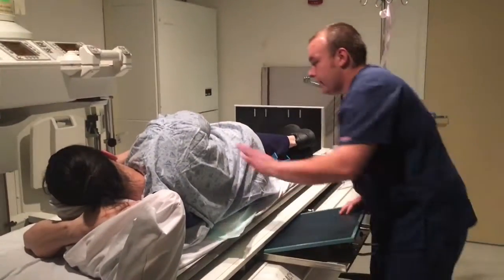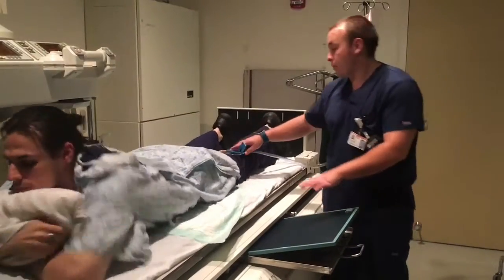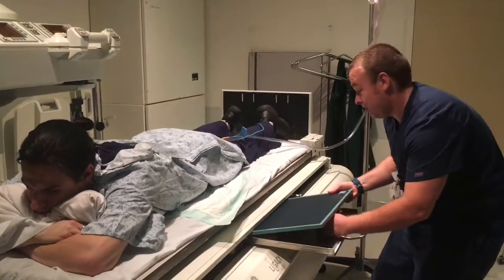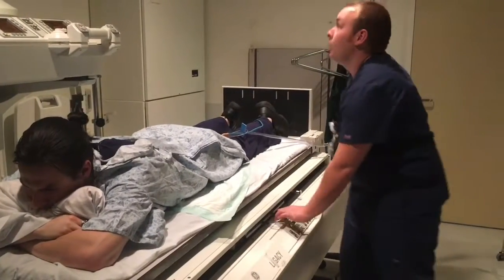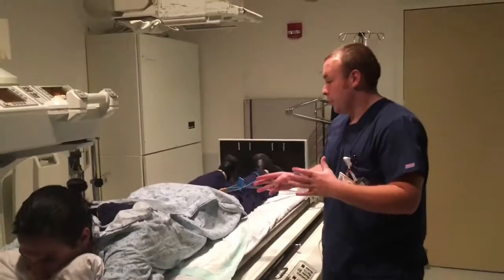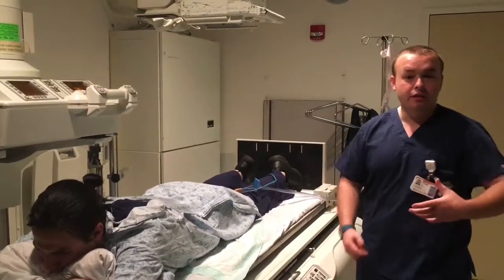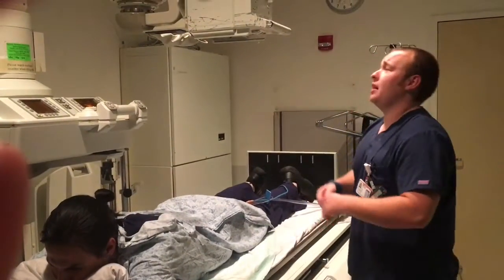Alright, go ahead and lay on your belly, sir. Anytime the patient moves, you want to make sure that the tip stays in. Otherwise, you're going to have a mess. The patient isn't going to be too happy. This film image, we're going to do a 10x14. You can use a 14x17, just depends on your protocol. I'm actually going to go 14x17 just because.